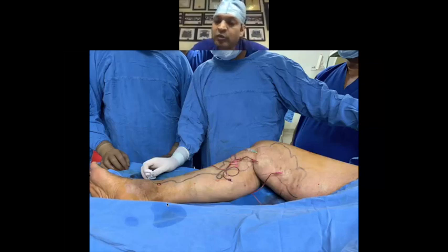So this is another protocol which is coming up these days, that you treat the main vein, leave the varicosities, and come after 6 weeks to 3 months, because the reflux will be gone, these veins will become smaller, and you have to use less foam or fewer phlebectomies. Another is you do the phlebectomies of all these varicosities. The third is you put in a foam. Now there are various ways of putting in the foam if you want to be totally non-invasive.